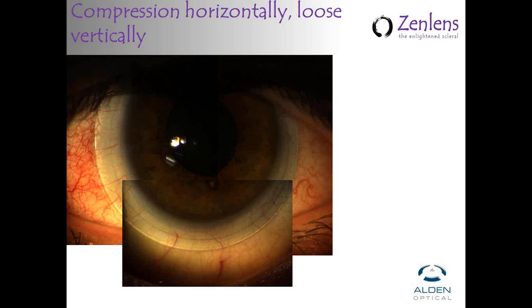So this is an example of an eye, I think this was one of Dr. Jedlicka's patients, where you can see a little bit of impingement and some blanching of the vessels. Some of the vessels are allowing the blood to pass through, but you can see it's being cut off a little bit on this side. It's a little bit whiter over here.